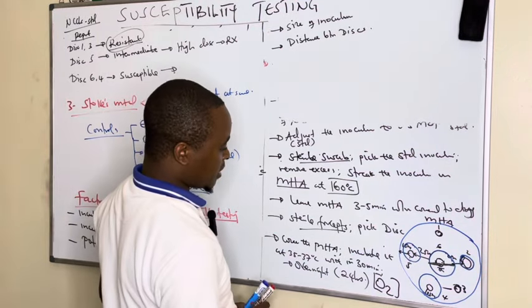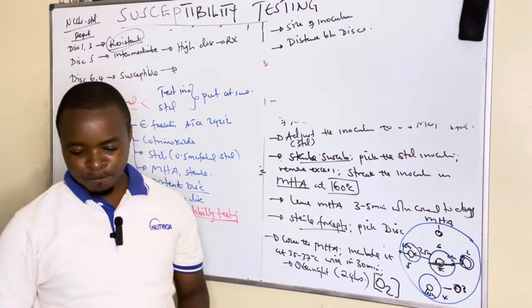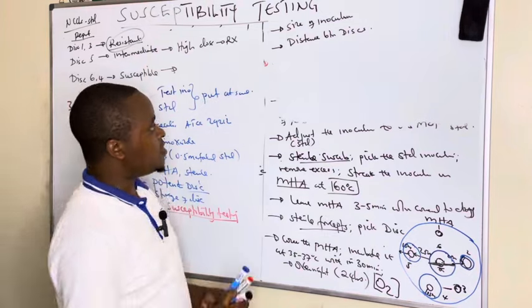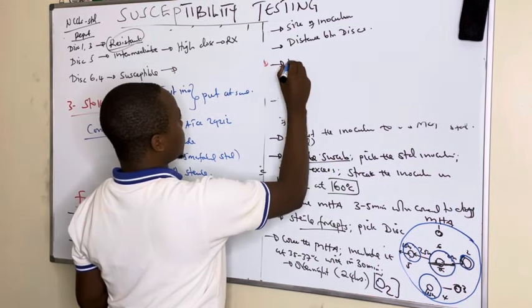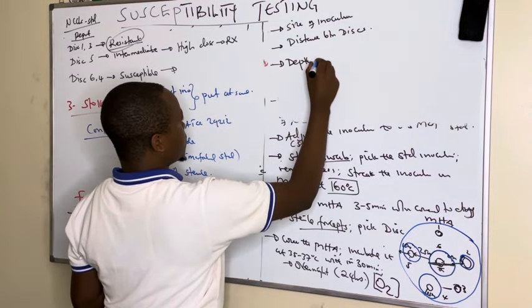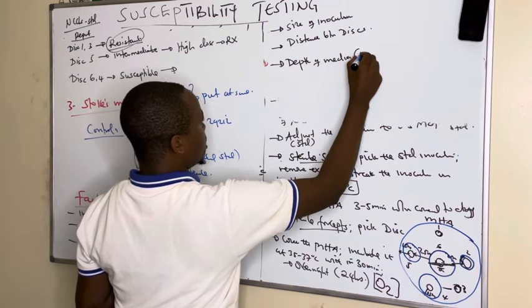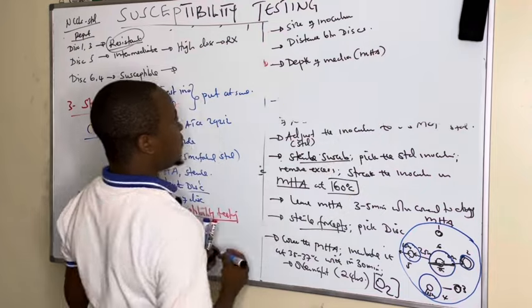So these are some of the factors we can talk about under this. Not forgetting about the depth of the media, Mueller-Hinton agar. So these are the factors.